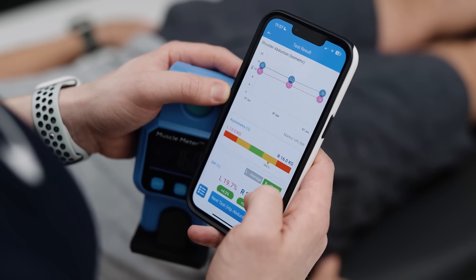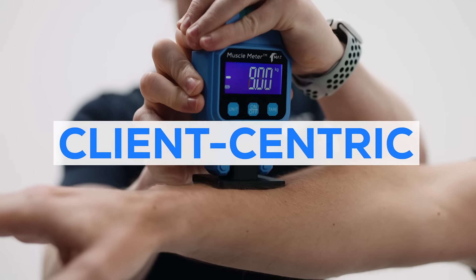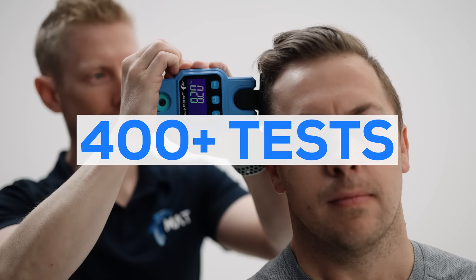Power it up with our Measures app and quickly and easily enhance your communication and outcomes with client-centric results alongside 400 other tests.